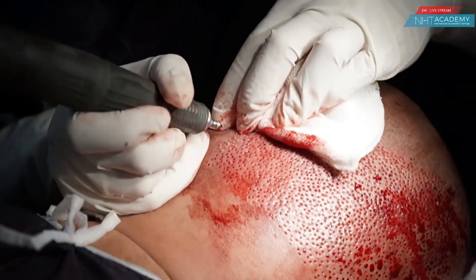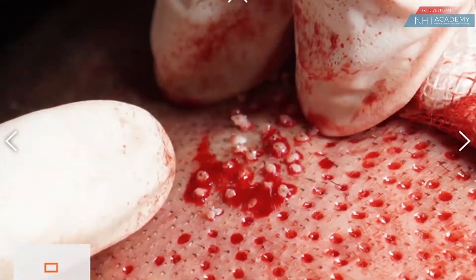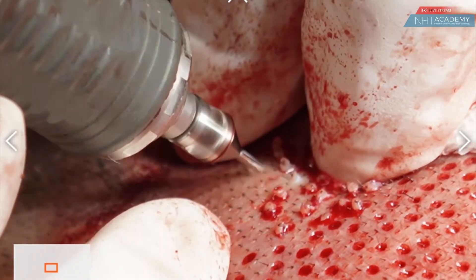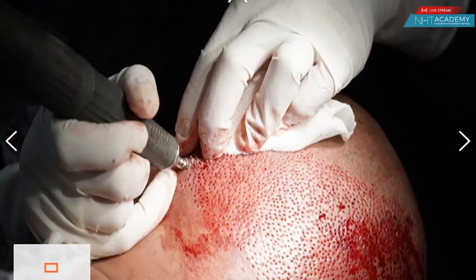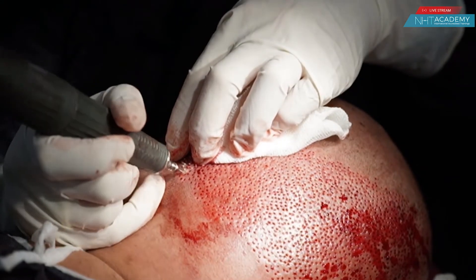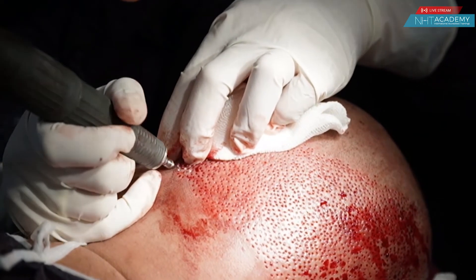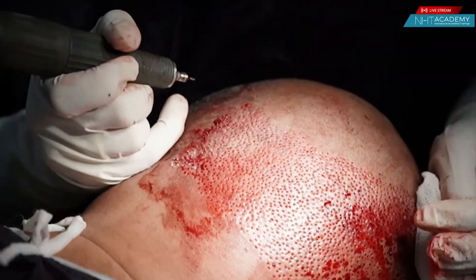Based on the other parts of the head, this is going a bit more easily and a bit faster. The grafts are quite long so we have to be very, very careful. I want to stress that two-thirds of the graft should be punched, not the whole graft. If you go through with the whole graft, you're going to get grafts that are stuck inside the punch and you will risk breaking or burning the grafts too. Only two-thirds of the way is the punching depth that you should go through with.